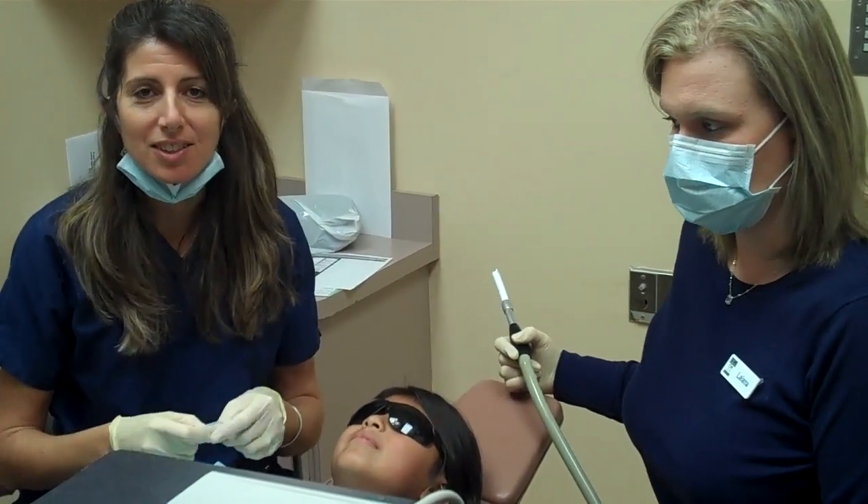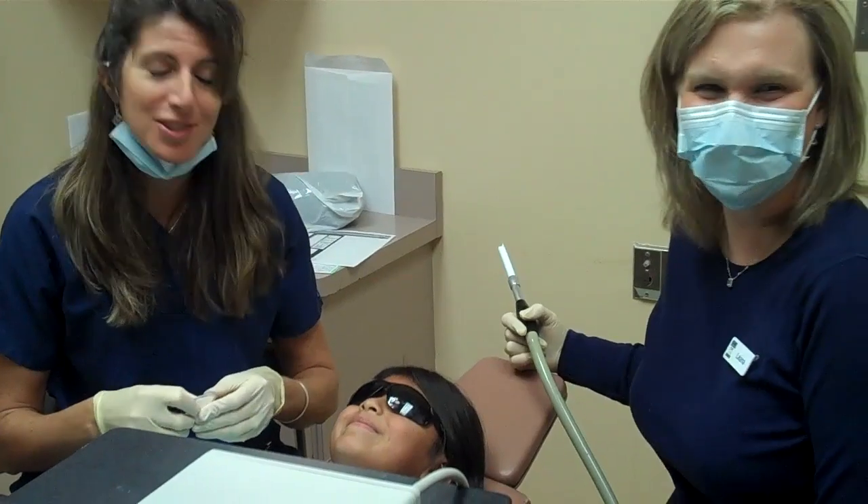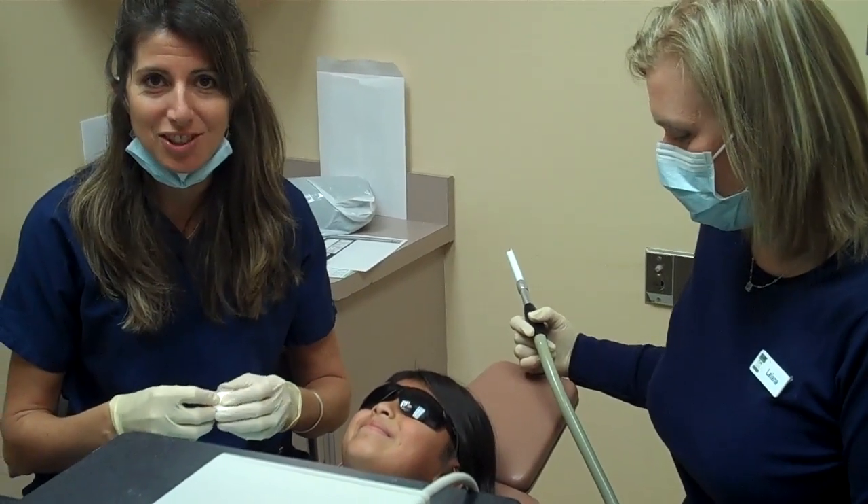Hi, I'm Clarice and I'm one of the hygienists here at Dr. Cohen and Schwartz's office, and this is Carlita. She's going to help us demonstrate how we put sealants on children's teeth.